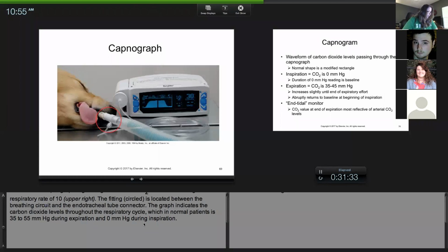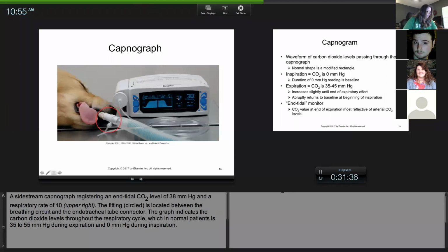So basically, it gives you the respiratory rate, it gives you the end-tidal CO2. Now, right on here in my notes, I wanted you to know 40 is the absolute normal. What's this space? Oh, that's a bar. It's just because they took a picture, it froze. As they inhale and exhale, that bar moves. So that's just a pause in the graph. That has nothing to do with the patient.